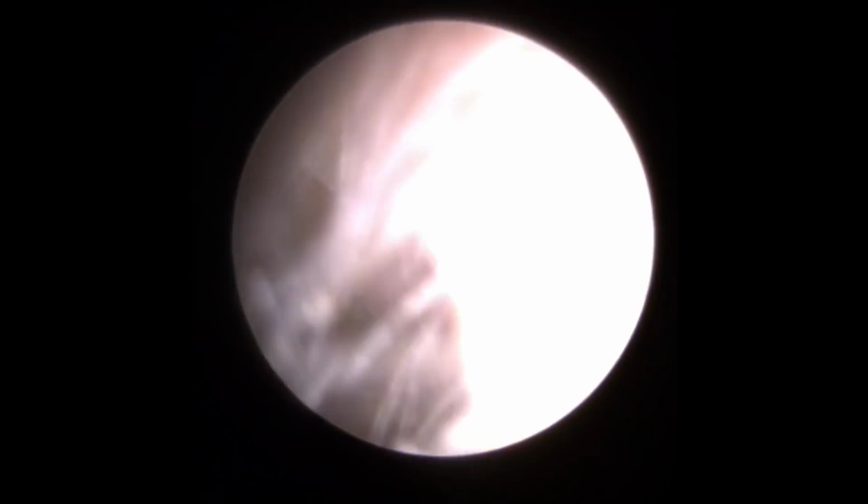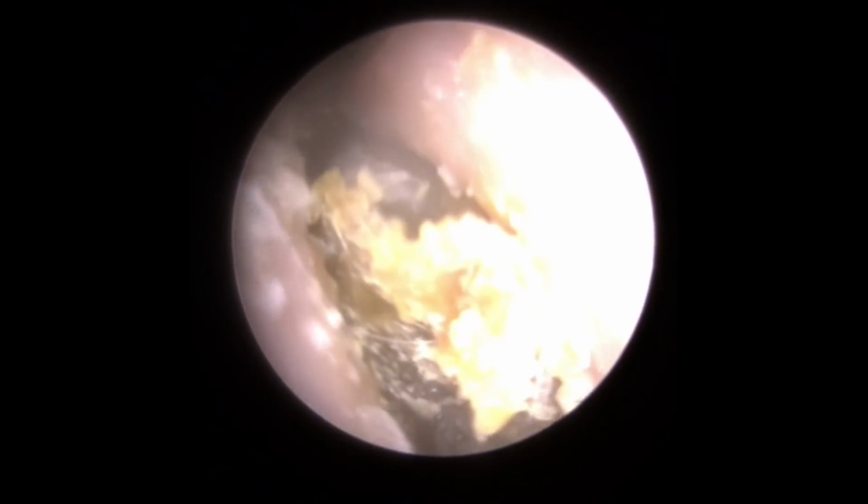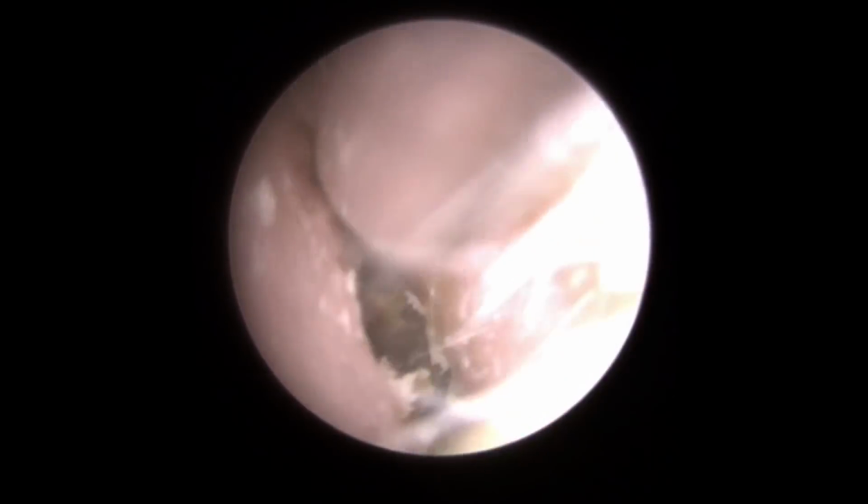There we are, just trying to get it. I've just managed to get a little bit of purchase on the top of the wax, but there, do you see that? It's so solid that as we're pulling, we're not really able to get that good grip. So I'm using the St. Bart's hook now to push into the wax again. You can see there we are, it's just broken that front section away again there.